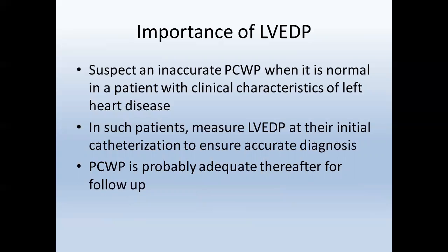If your leg, I do myself, radial, I get, but like that, you just have to take the extra steps and get the answer. So the teaching is, don't come out of the cath lab without an answer for your patient. Would you come out from a coronary angiogram without knowing what the lesion is? If you have questions, you put in an FFR and study the lesion. You need to know exactly what the answer is for the patient before you come out.